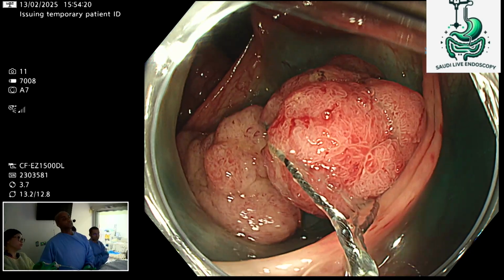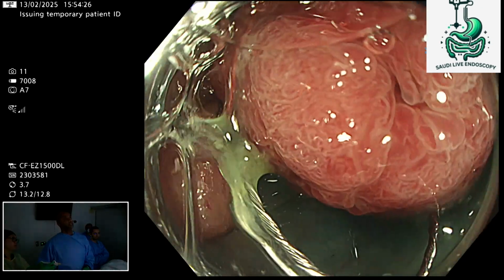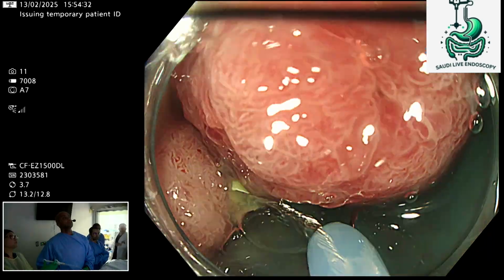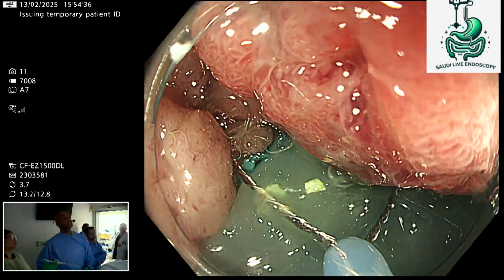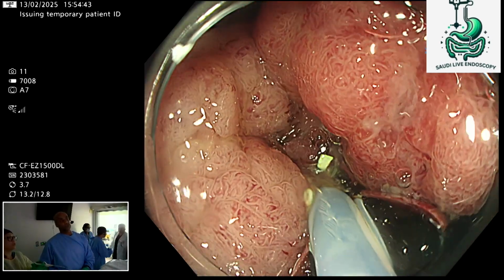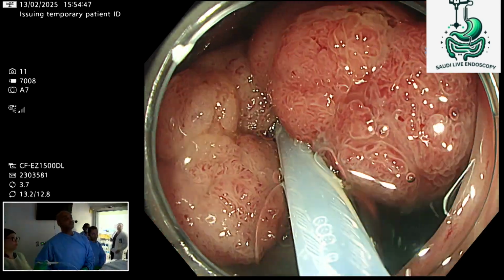Recurrence in the era of thermal ablation of the margin is not there. The problem is you don't know about the lymph node. When you do surgical resection, you take en bloc all the lymph nodes. Yeah, but this is a benign lesion, doctor. It's not a cancer. So there's absolutely no risk for submucosal invasion. If it becomes a cancer, that's a different matter. Okay, thank you.